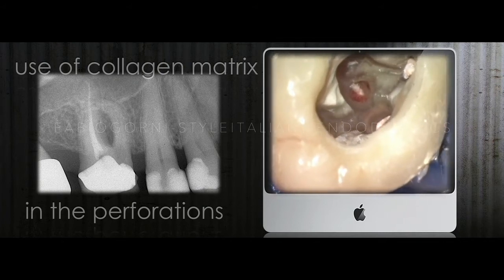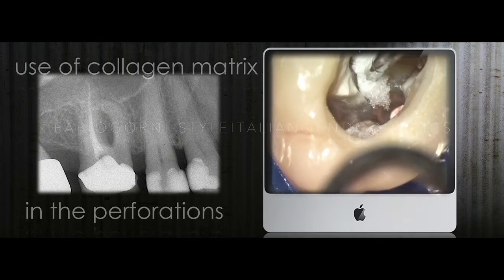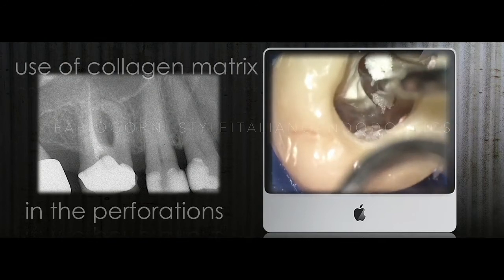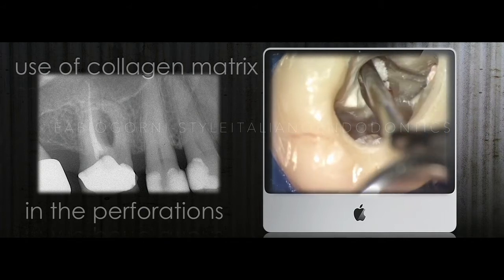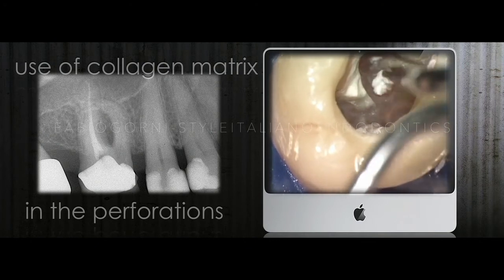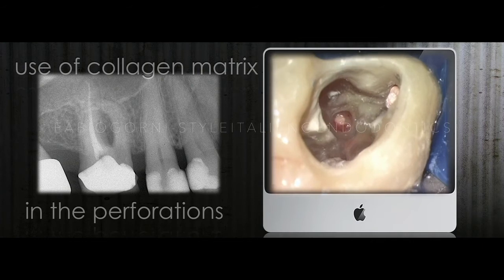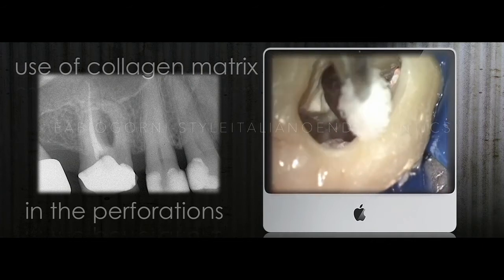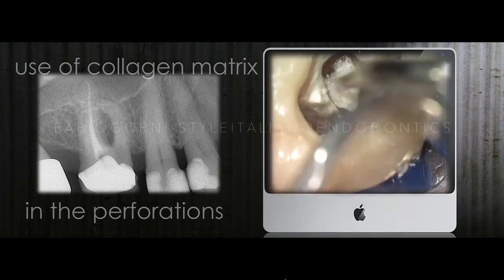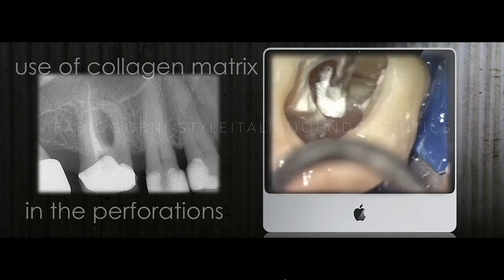Sometimes we have to push a lot of material outside of the root, especially when we are talking about an old lesion, like in this case. The defect outside of the root is a big defect, and we have to push material outside until we can obtain a nice surface. Over that we can then pack our material.